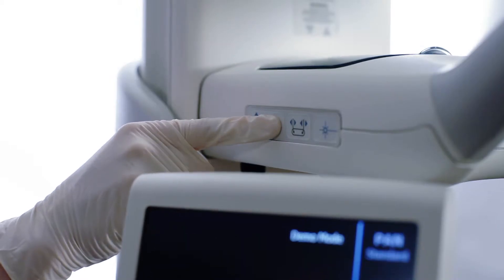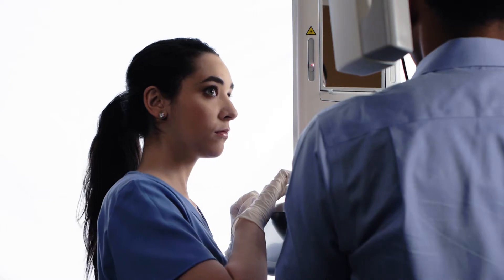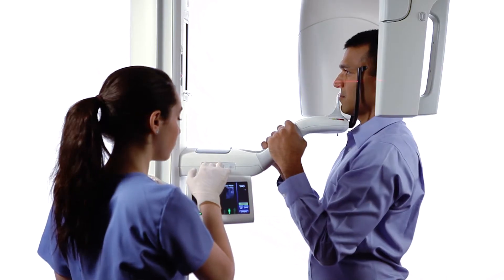After the Frankfurt laser has been set, use the height of the positioning table to tilt the patient's chin higher or lower to bring the Frankfurt plane horizontal.